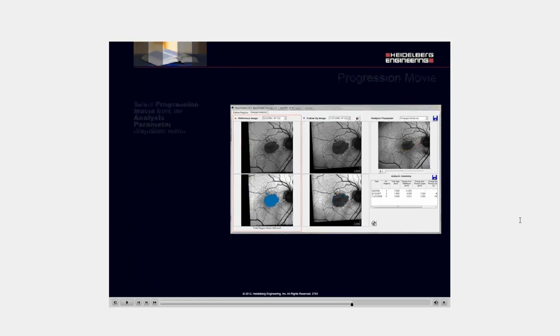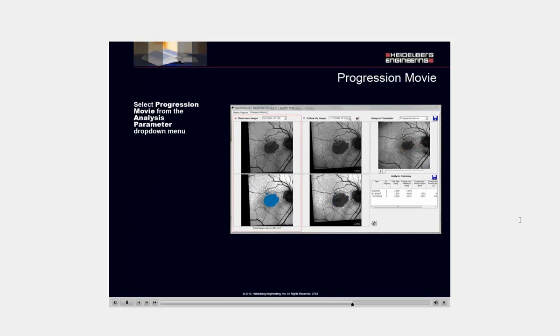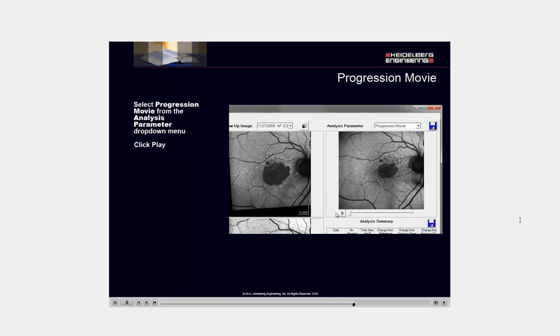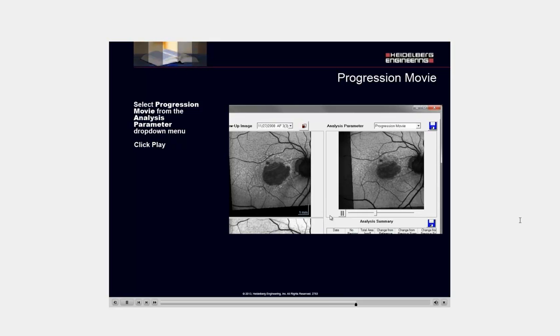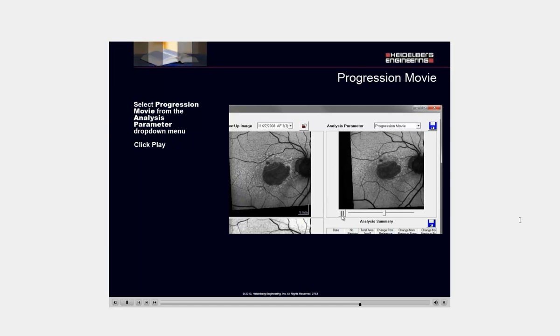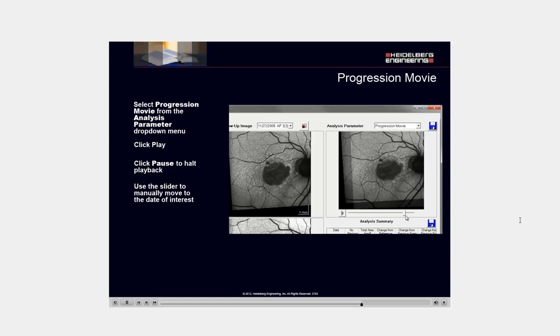Select progression movie from the analysis parameter drop-down menu. Click play. Click pause to halt playback. Use the slider to manually move to the date of interest.